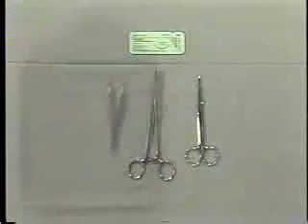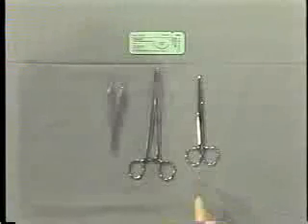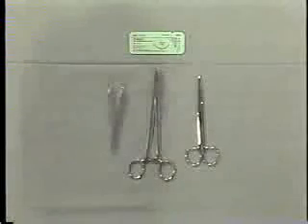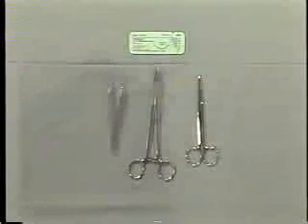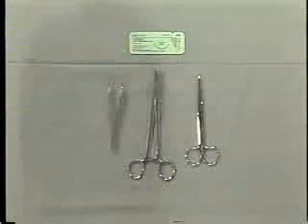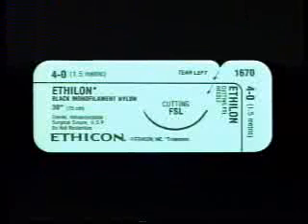It is helpful if you have pickups, needle holder, and scissors, as well as appropriate suture. For a simple skin laceration, generally, monofilament, non-absorbable suture is appropriate. If you do use subcutaneous suture, an absorbable suture is best. We'll use 4-0 nylon on a cutting needle for this wound.